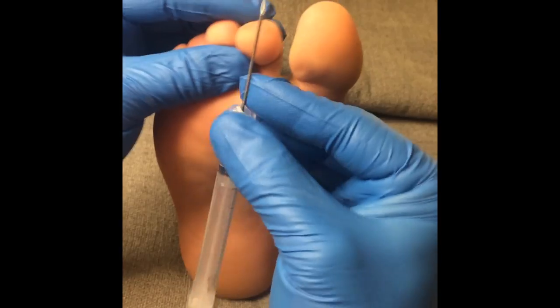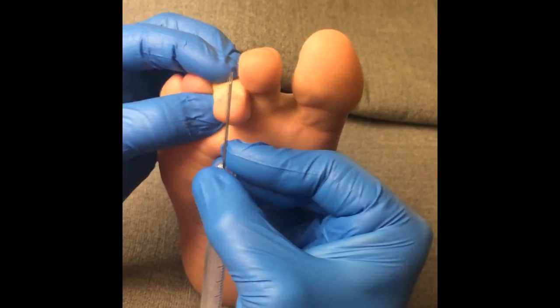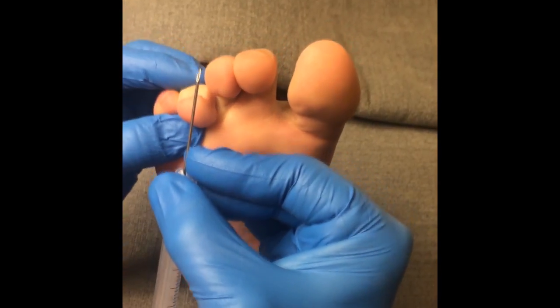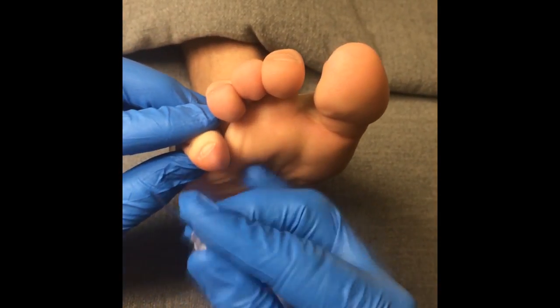The instrument is inserted perpendicular to the orientation of the nail plate or proximal interphalangeal axis. Note that the individual digits may present with frontal plane variations such as a varus rotation of the fifth digit in this example.